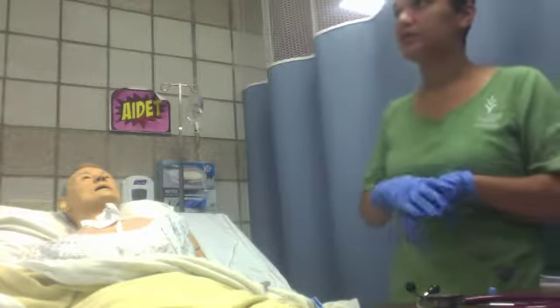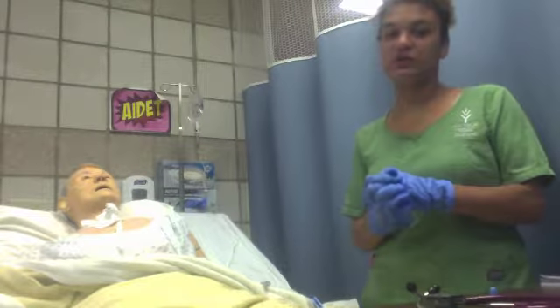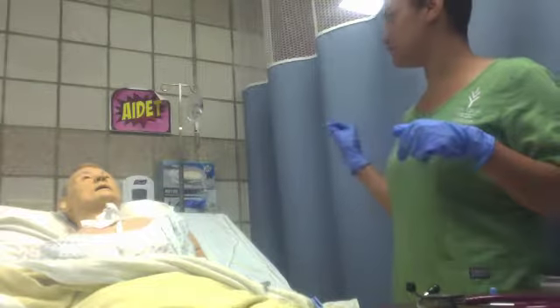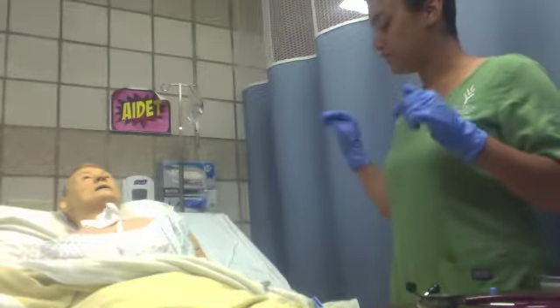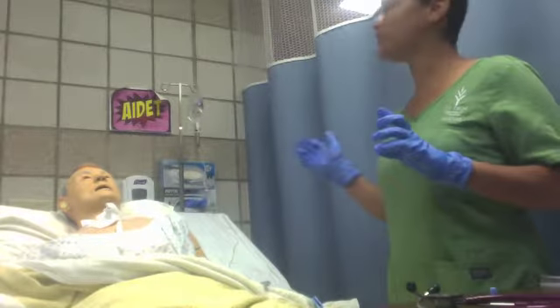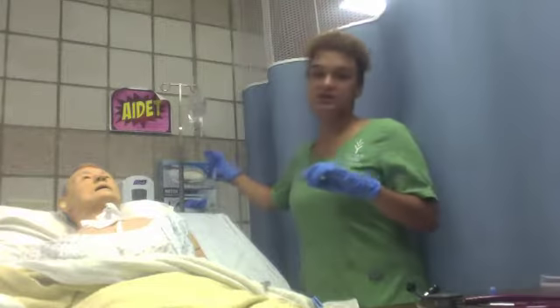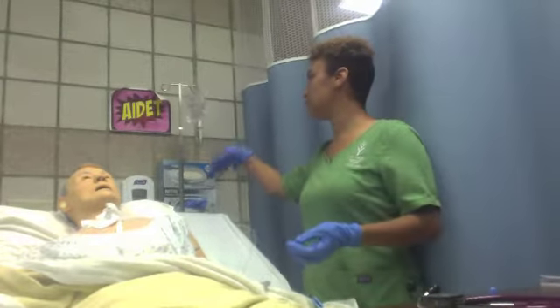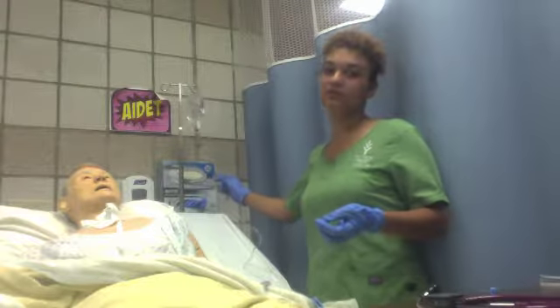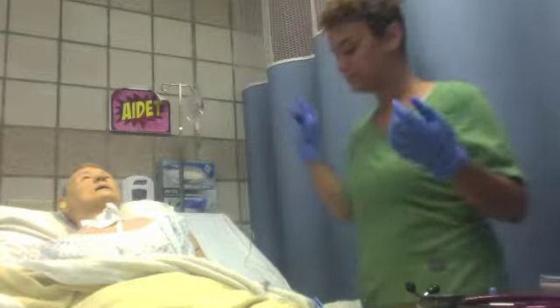Looking at the monitor, making sure that it works properly, that there's no issues, that there hasn't been any issues. So I looked at the bag, I looked at the drip, clamps are open, no leakage. All right, so everything up here looks good. I'm looking at expiration dates of also the tubing itself, making sure that that's appropriate, and then the usage is appropriate for the medication or the therapy that is being provided.